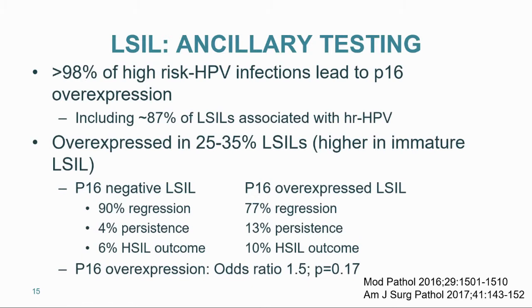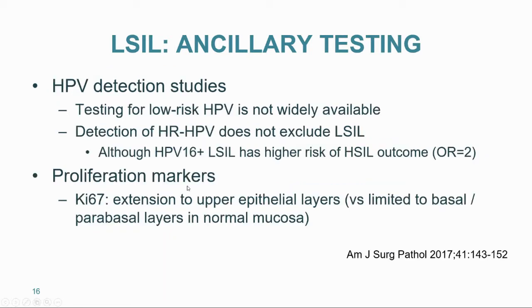What I'm trying to say is that those LSILs that overexpress P16 are probably a little bit different, but not significantly different from the other LSILs that would not overexpress P16. And that's why we still understand them under the same basket. We still classify them as LSIL predominantly based on morphology.